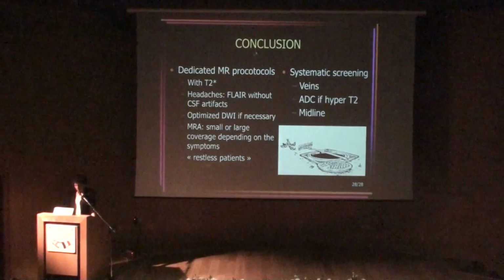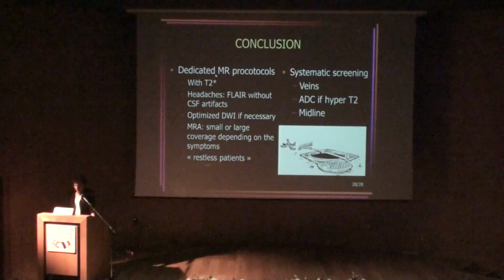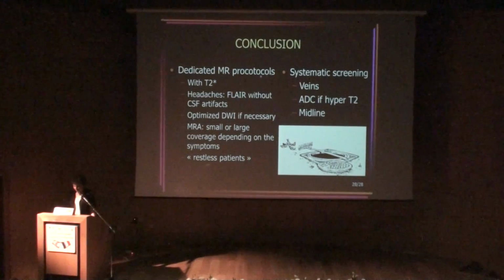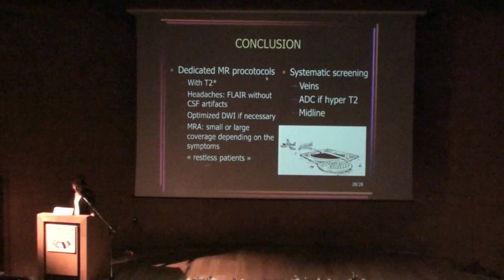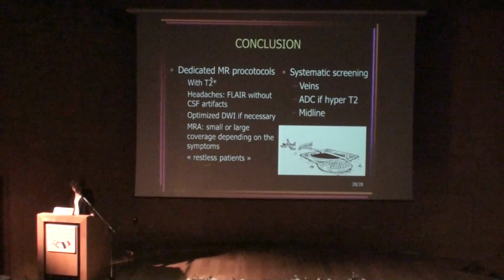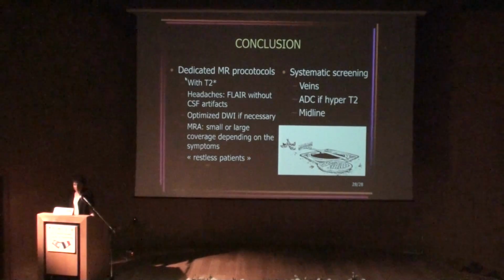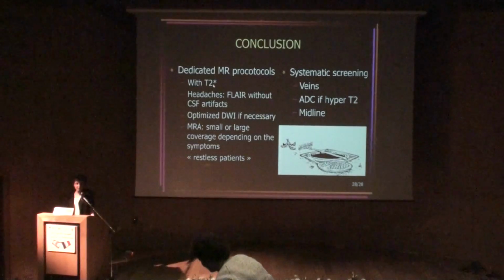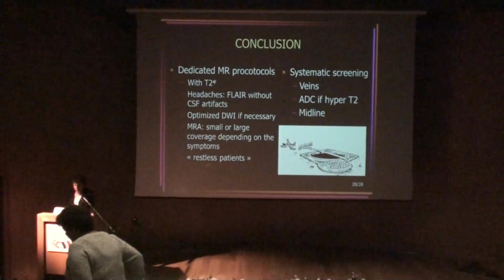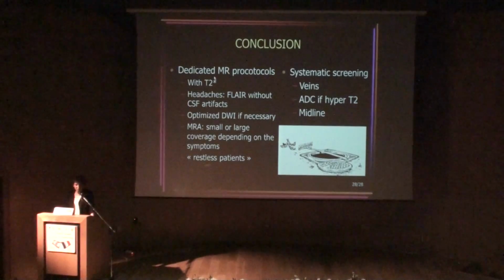So as a conclusion, with a dedicated MR protocol, that means a T2 star weighted sequence, whatever you want, susceptibility or basic ones, but everywhere in every protocol.